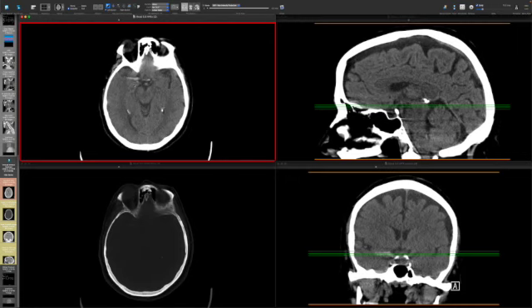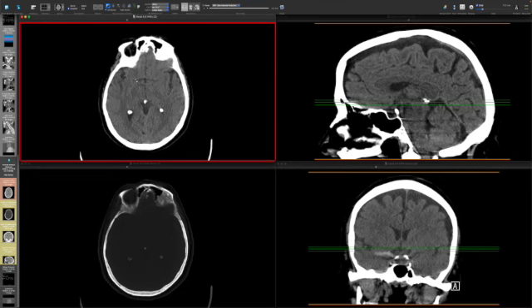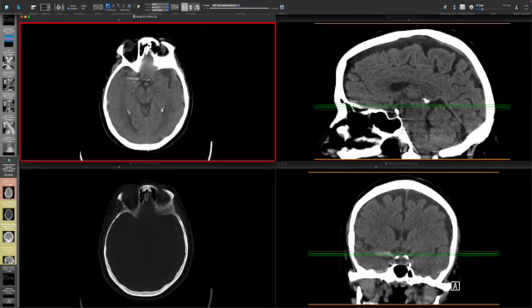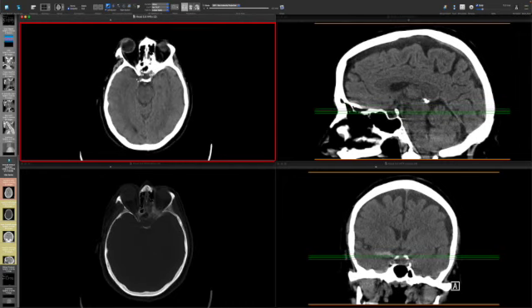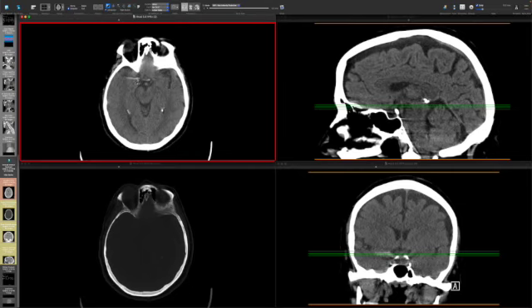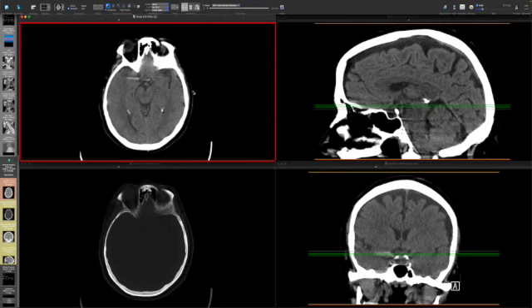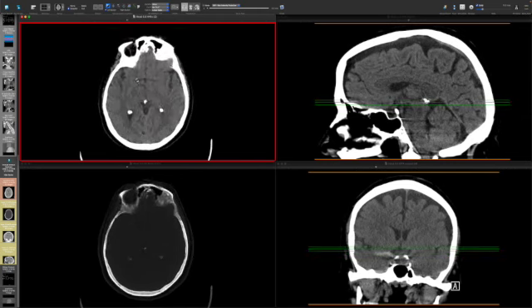Now, the pertinent finding in this case is there's this linear area of hyperdensity down here in the right temporal region. It's linear. It looks extra axial. And this is actually hyperdensity within the proximal portion of the right middle cerebral artery. You can see for reference, here's portions of the left middle cerebral artery and the basilar artery are not nearly that dense as this right middle cerebral artery. So this is a hyperdense right MCA sign. It is the earliest finding of stroke that we can see on a head CT. And it's an indication that there's actually clot or thrombus sitting in the artery itself.